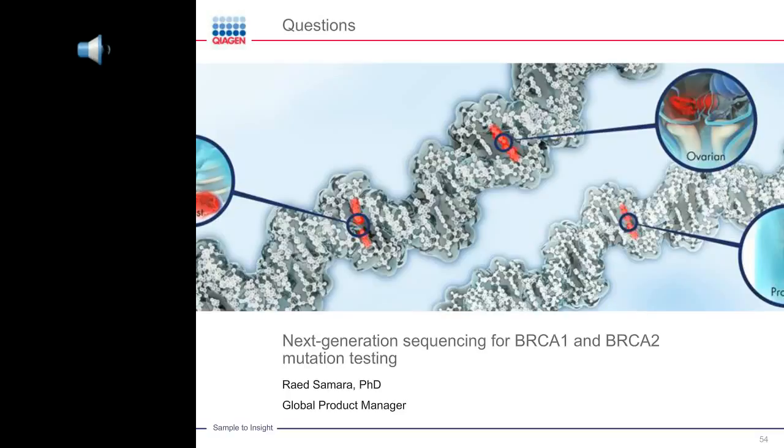Great. The second question someone asked is, can the panel be used for liquid biopsy? The panel can be used for liquid biopsies because it generates small amplicons, so it is very compatible with the fragmented nature of liquid biopsy DNA.